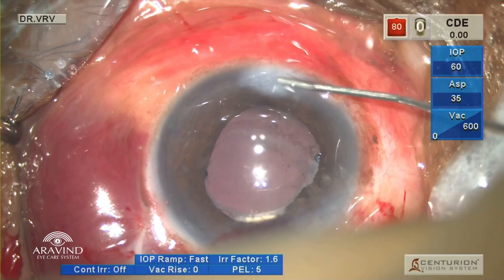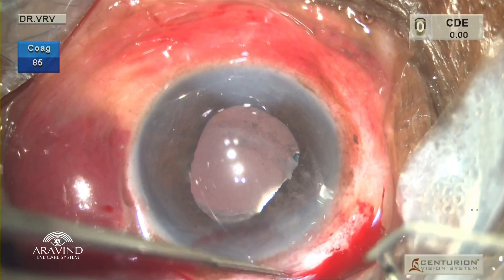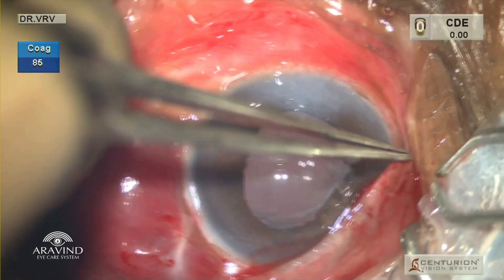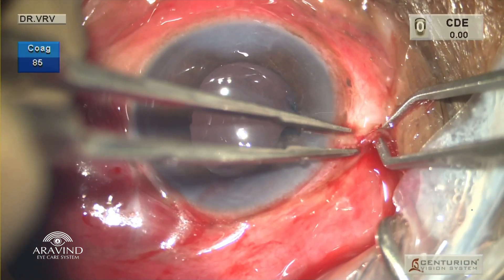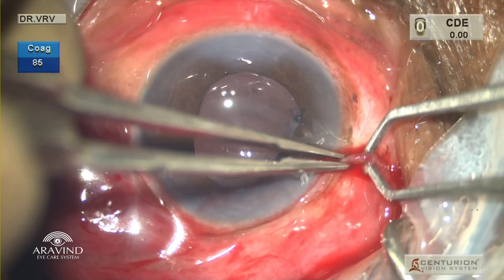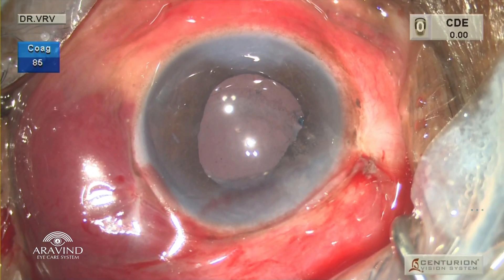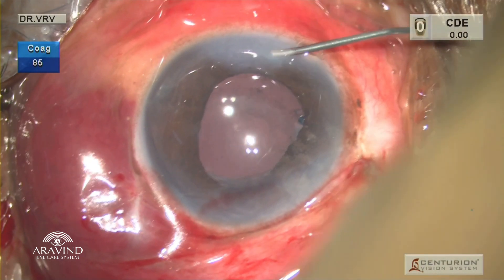Once the viscoelastic is all out, the paracentesis is hydrated using balanced salt solution. As mentioned earlier, the conjunctiva in such cases is very fragile and brittle, so it's very important that we oppose the conjunctiva very carefully and avoid a conjunctival tear. Once the conjunctiva overlaps a little bit of the limbus, it is then cauterized. Intracameral moxifloxacin is given.